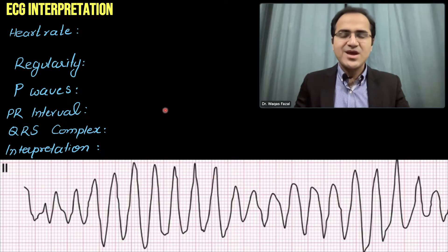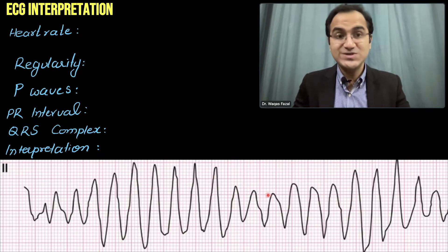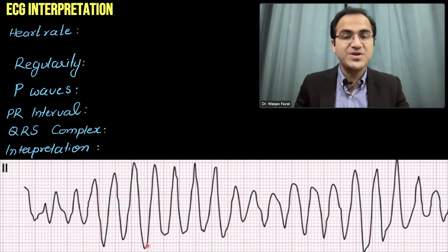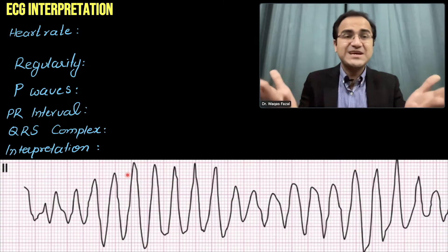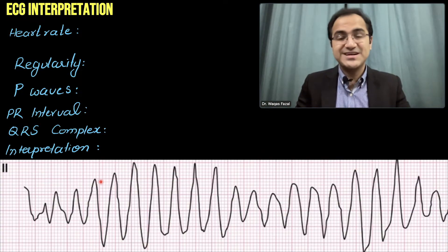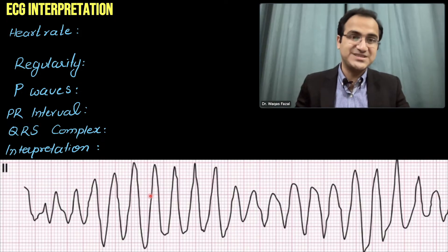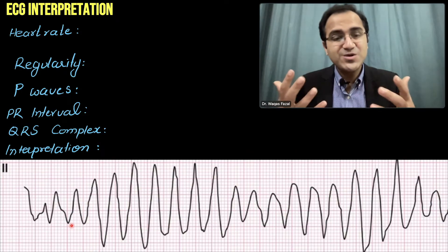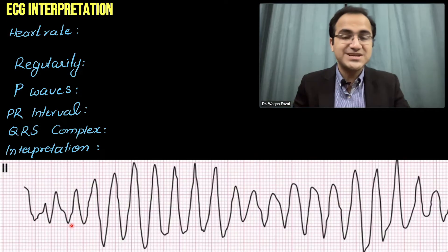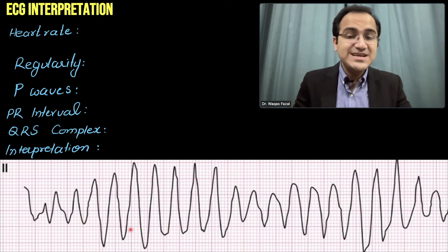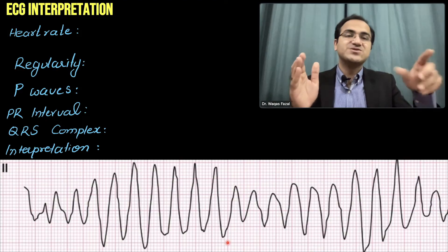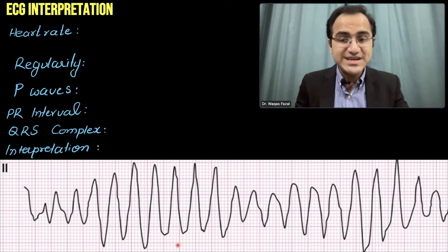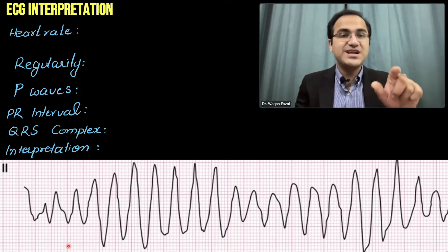Looking at this ECG showing torsades de pointes — these are the pointed ends and these are the round ends, demonstrating the twisting around the points. To calculate the heart rate: the atrial rate cannot be calculated because there are no P waves visible. For the ventricular rate, we use the six-second method. We count 30 large boxes and the number of QRS complexes within them, then multiply. Since we have a short strip, we will take 15 large boxes and multiply by two.